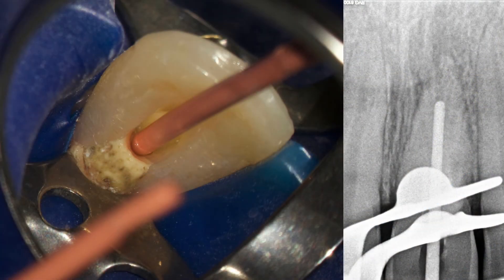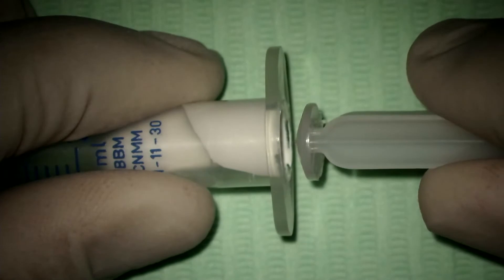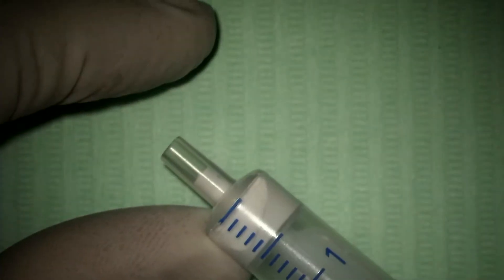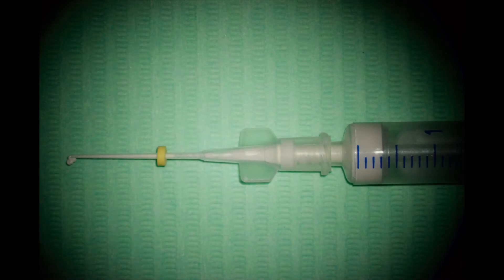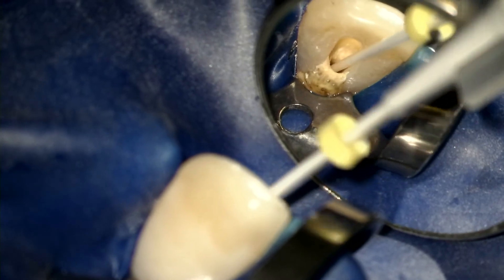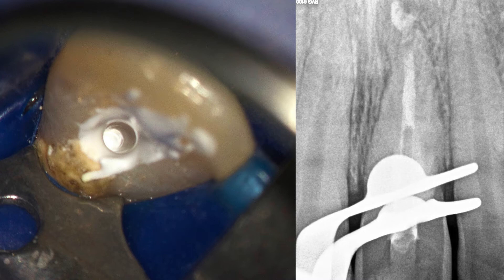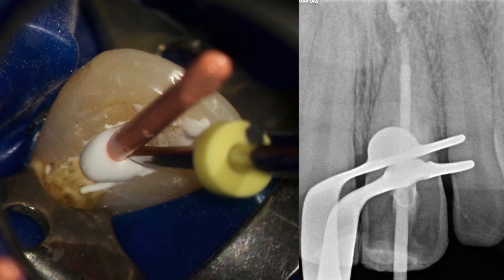Gutta-percha was placed 2 mm short of the working length. We used Bio-Root canal sealer for filling. After mixing for 60 seconds, it was loaded into a syringe and delivered with a small tip. After filling the canal with Bio-Root, the master cone was inserted.